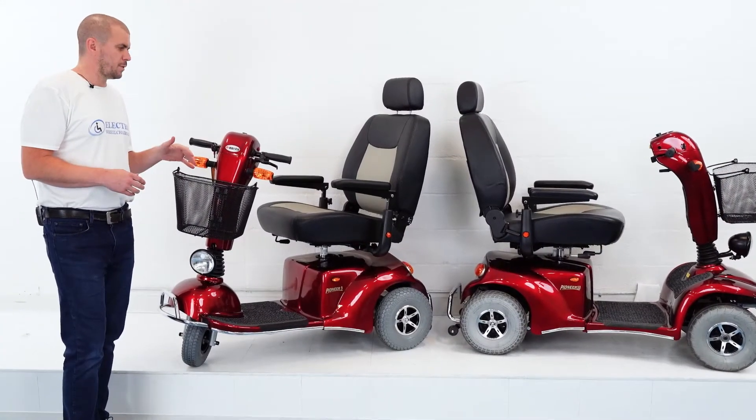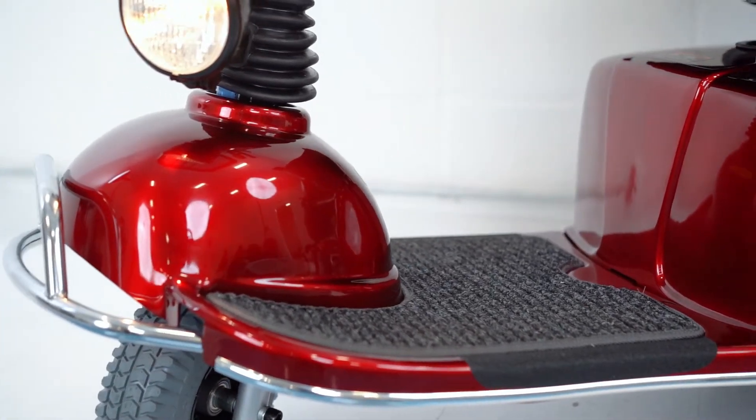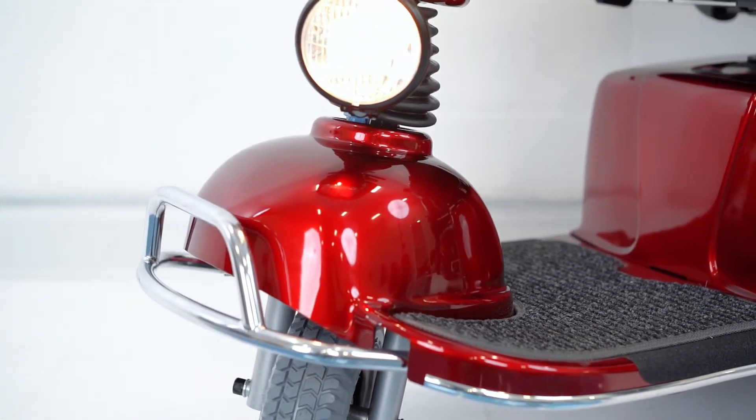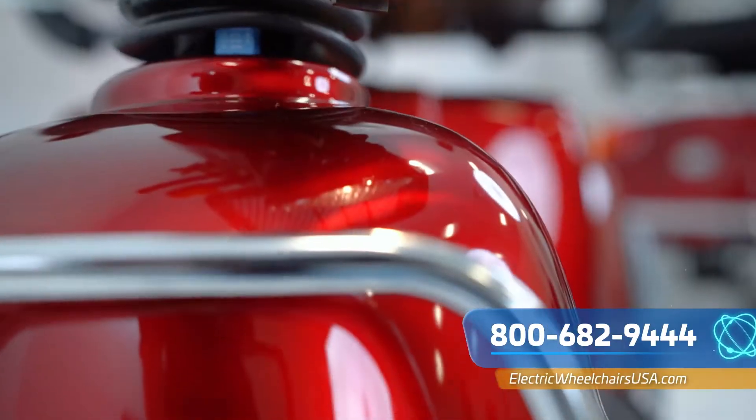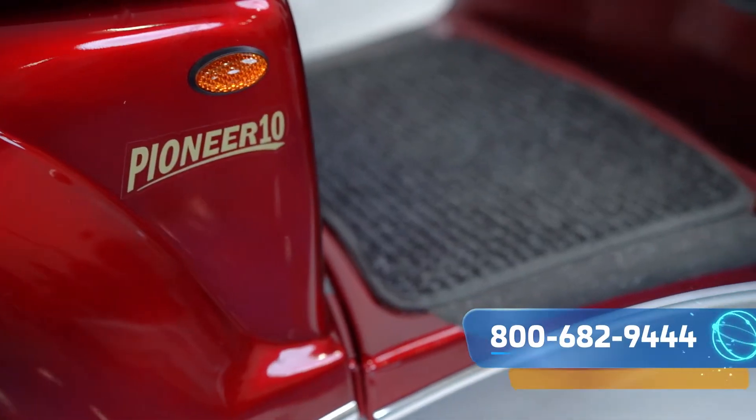The biggest difference between the three-wheel and the four-wheel model is the turning radius. If you're looking for a unit that can maneuver around tight corners and make a sharper turn, you're looking at the three-wheel. If you want more stability, you want to go with the four-wheel unit.